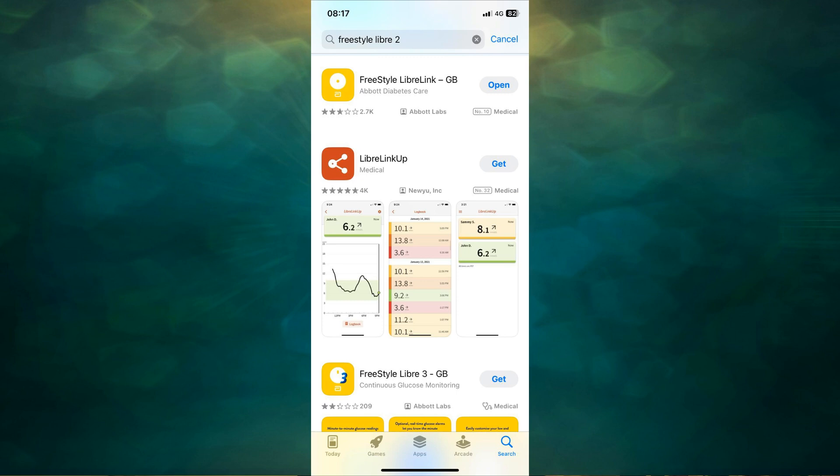We don't recommend checking blood sugars using both simultaneously — we advise either one or the other. To show you how to apply this sensor, first I need to show you how to create an account. If you have an app store on your phone, please download the LibreLink app. You need a compatible phone to use it.